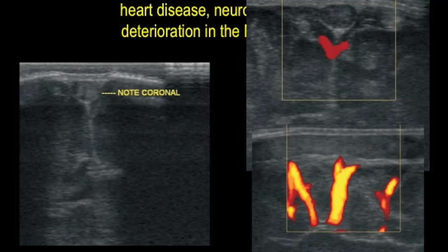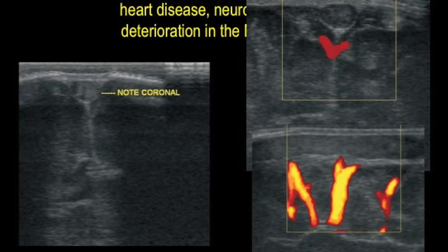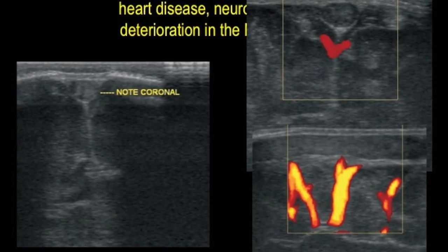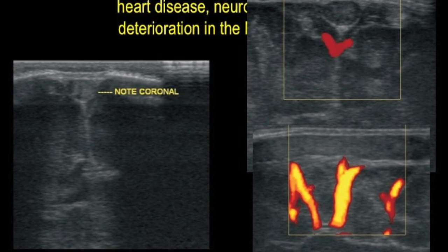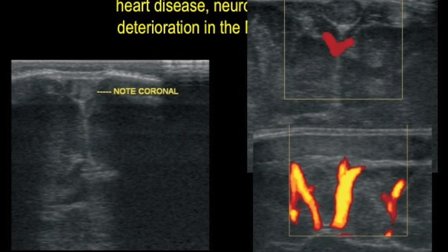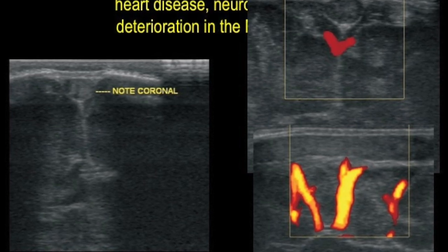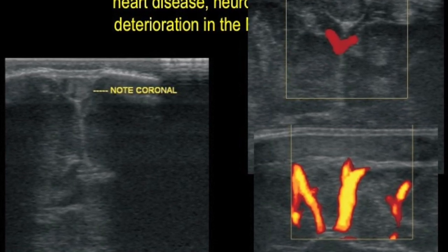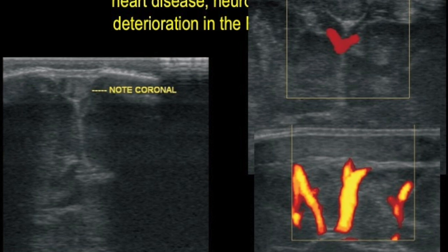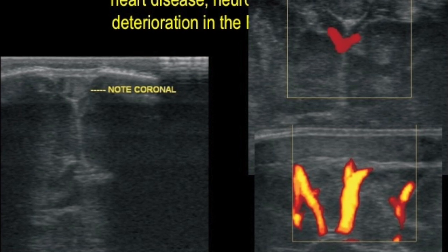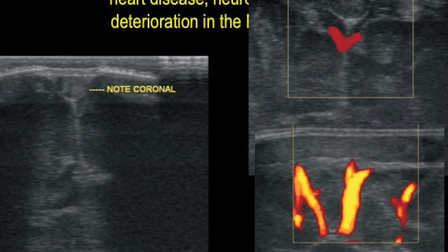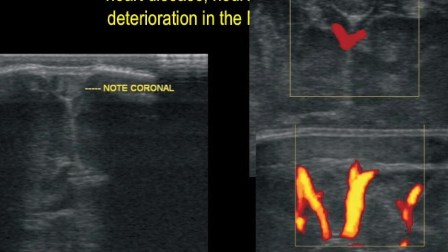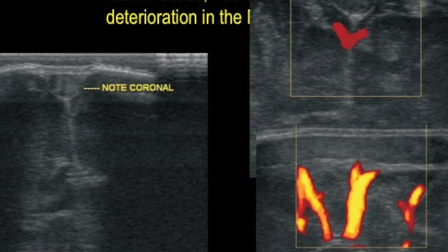This is a 32-weeker who was operated for congenital heart disease. There was neurologic deterioration and hence a neuroultrasound was asked for. High-resolution images show a dilated or distended midline structure filled with echoes, not filling on color.